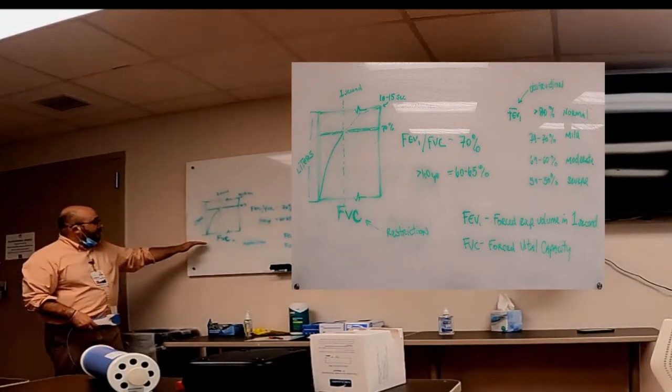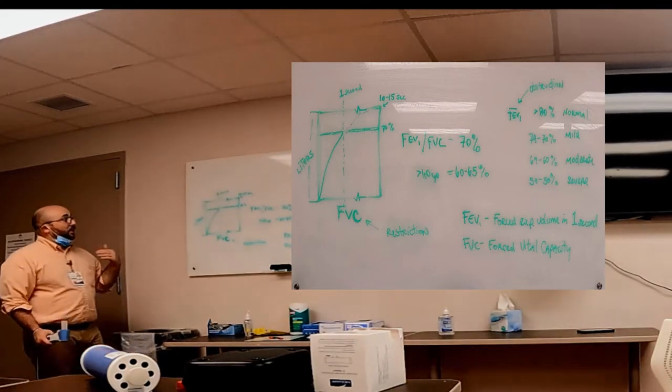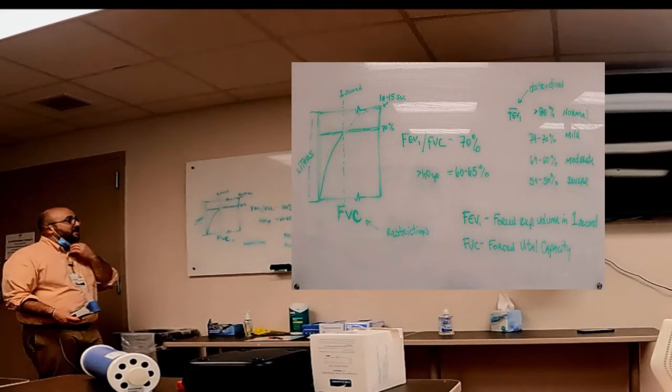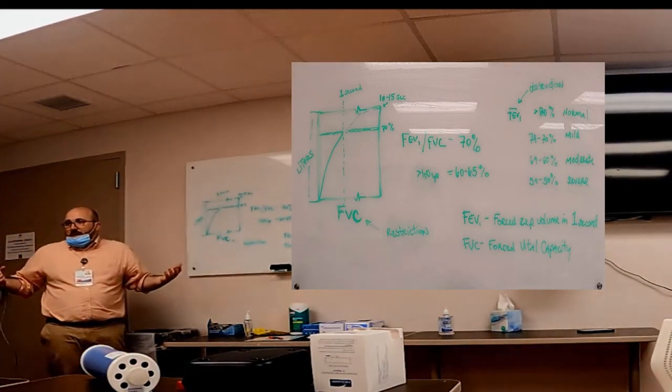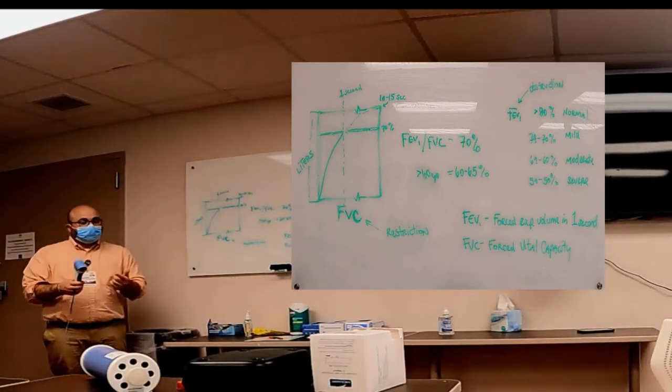So if I do Chelsea's and her FVC is below her predicted, which means 80% or below, that means she has some kind of restrictive lung disorder. She doesn't have as much volume as she should, right? It makes sense. So how do they know what your normal volume is? They go by a couple different things.